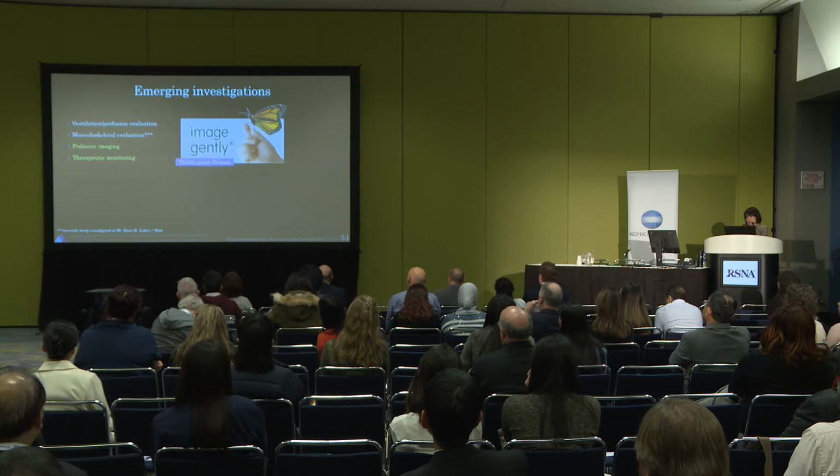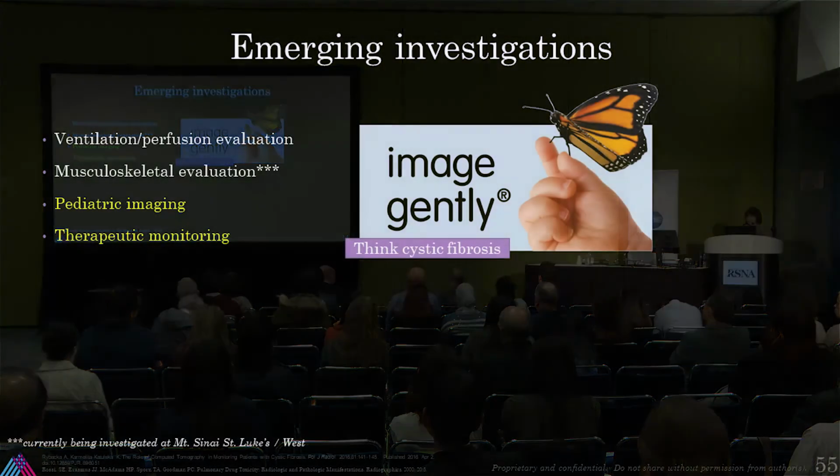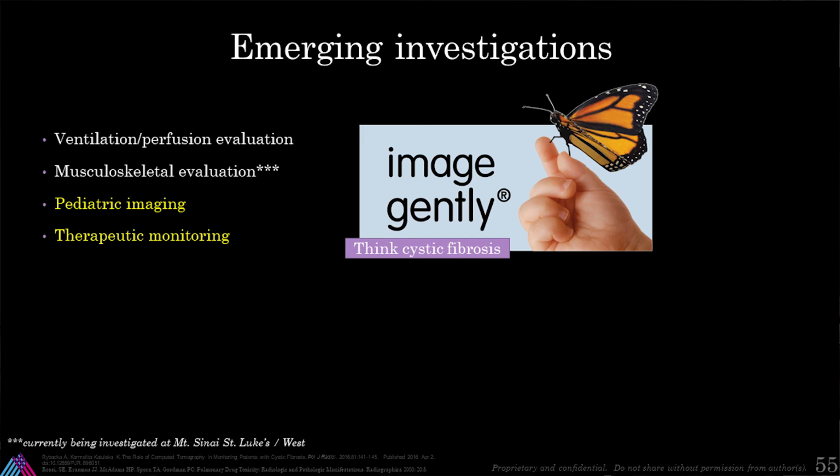And going into pediatrics, Image Gently is a huge movement in pediatric imaging. And as we had alluded to at the beginning of the presentation, there's a much lower dose with flat panel detectors and digital radiography.